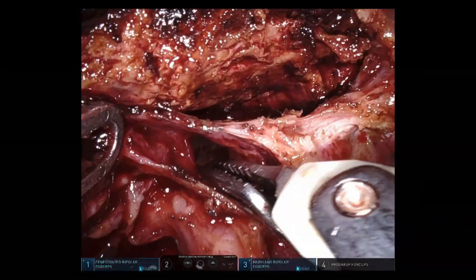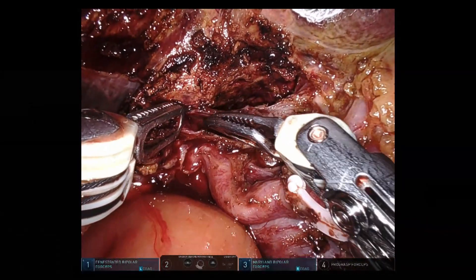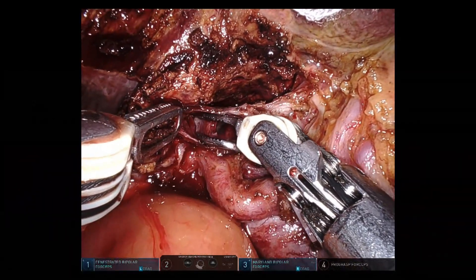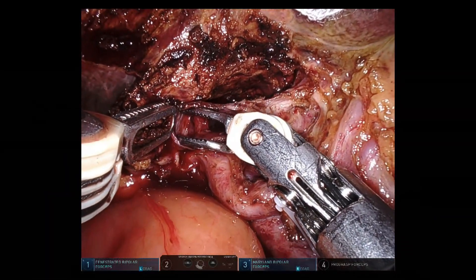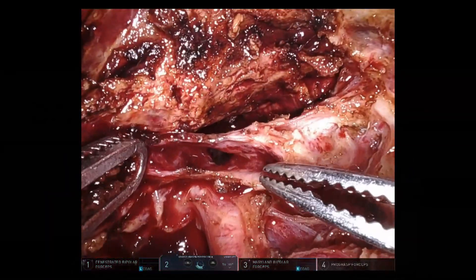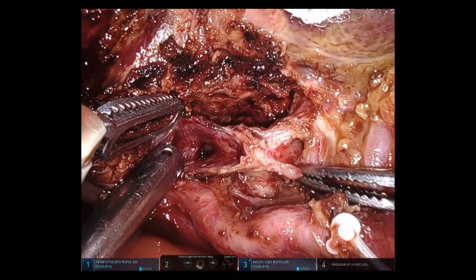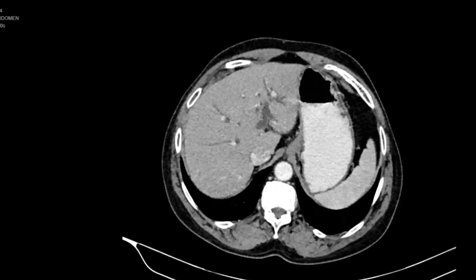Post resection, we can observe the segment 5 and segment 8 duct joining to form the anterior sectoral duct, the posterior sectoral duct, and the left hepatic duct. Next, we will describe the hilar bile duct resection with liver resection.